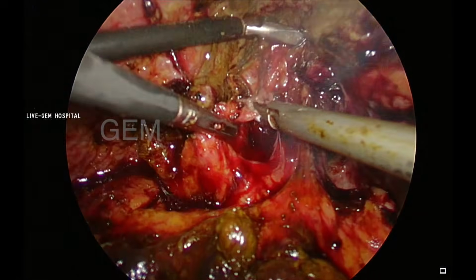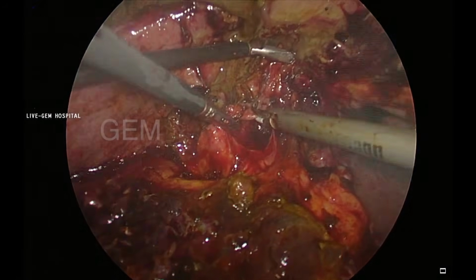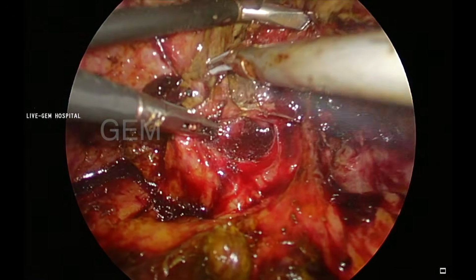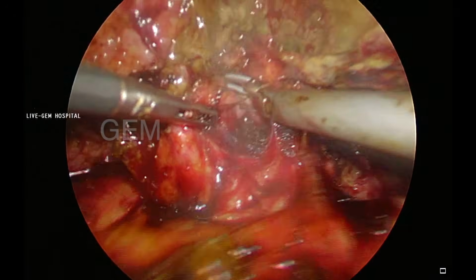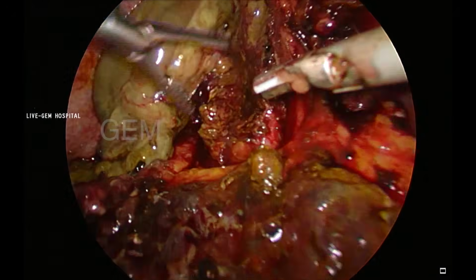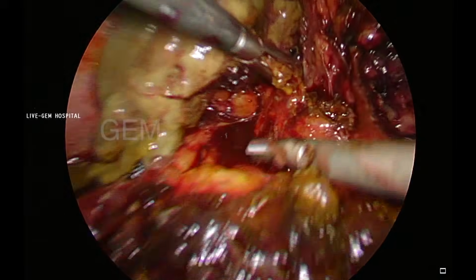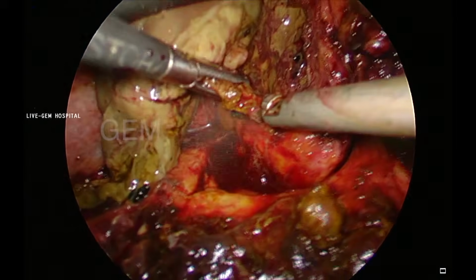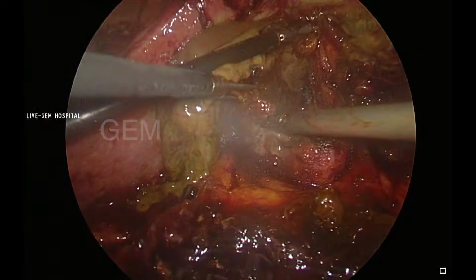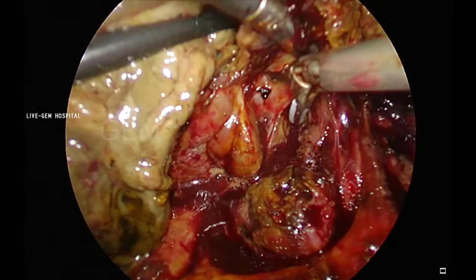Maybe if you use ICG in this case, it would have been helpful during surgery for identification of the CBD. This case was not done that way, but real ICG use is like this. Whether I can go for medial dissection in this situation, or go for a subtotal, the ICG will guide us in this kind of situation.